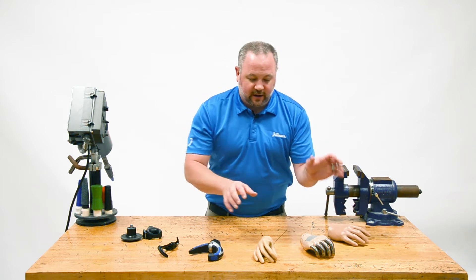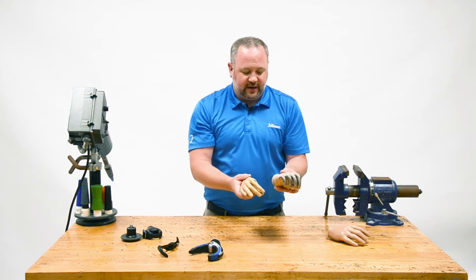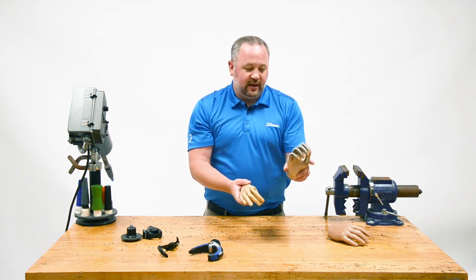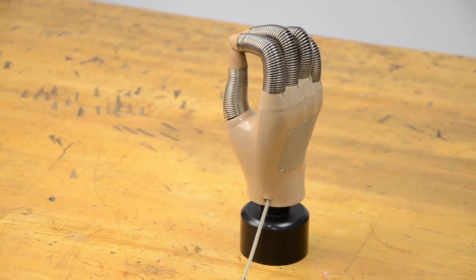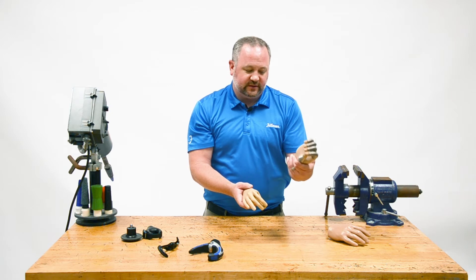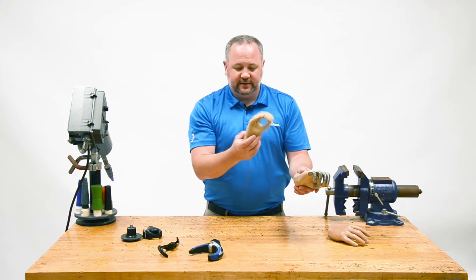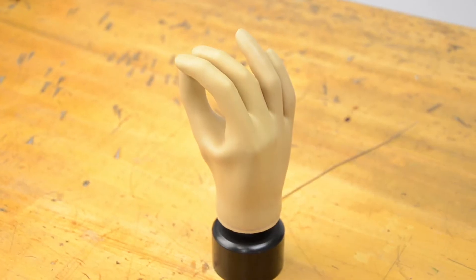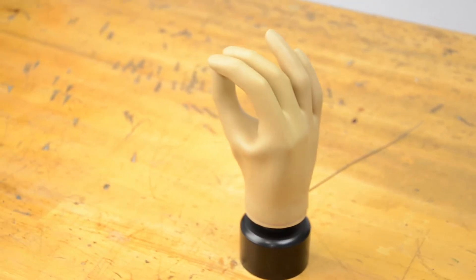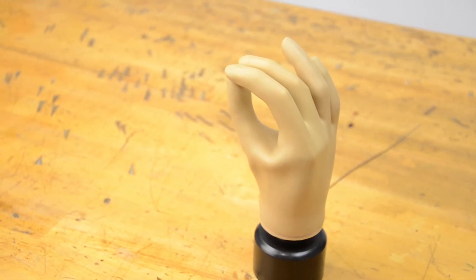The other option is mechanical hands. They've been around for a long time — from the heavy-duty hands we used to use, which we still use quite often for patients who need something really heavy duty but want something that looks a little more cosmetic, to the soft voluntary closing hands that are a little lighter and more modern.